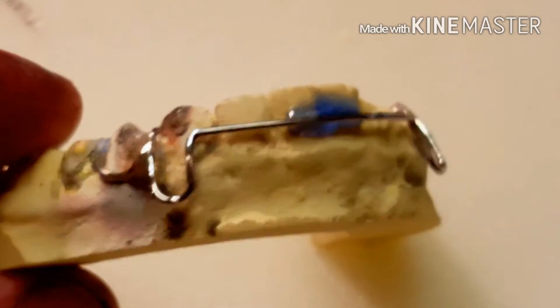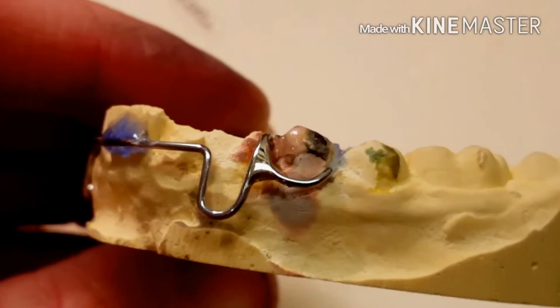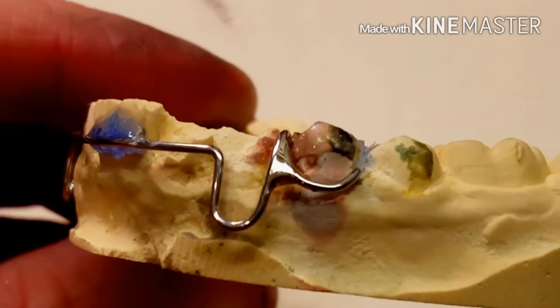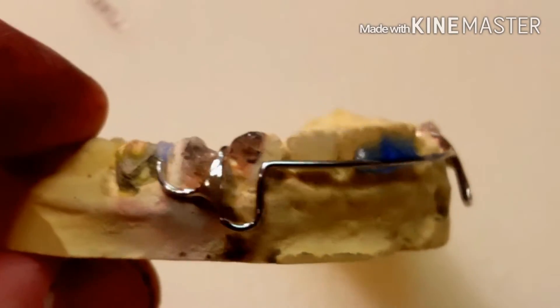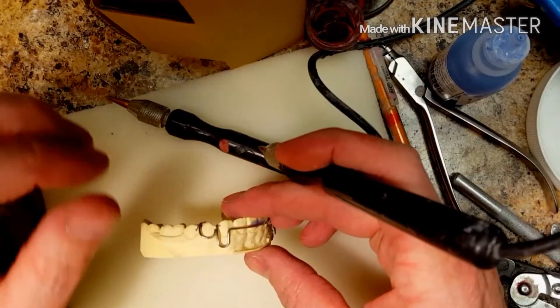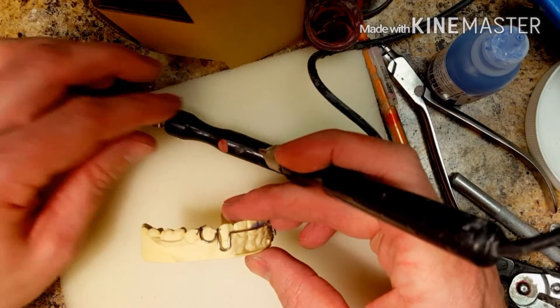Hi, this is Steve. I'm giving you a quick tutorial on how to solder a C-Class to a Holley retainer bow. This is the first demonstration model, so here we go.